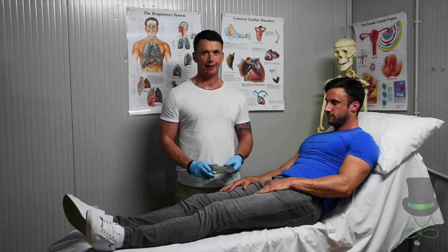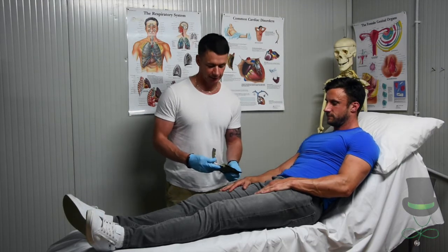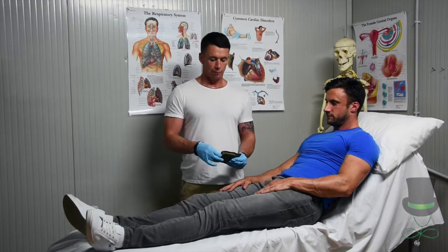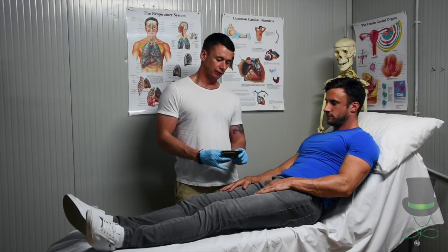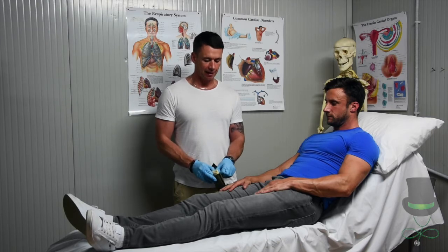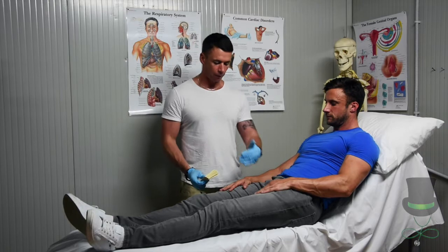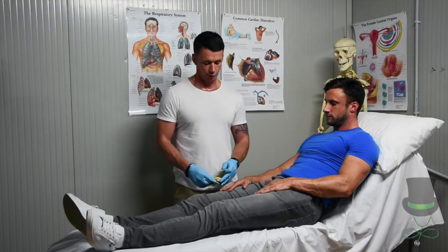Hi, I'm Anthony and I'm a paramedic and I'm going to demonstrate to you today how to use hemostatic gauze. We remove the hemostatic gauze from its protective packaging and keep the packaging so we can place the gauze on it when we're packing in the wound.